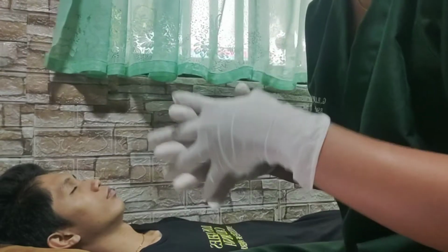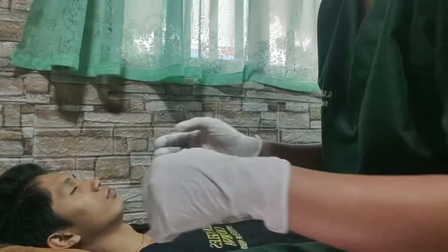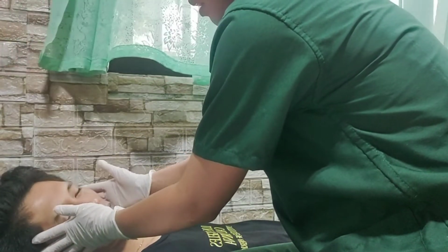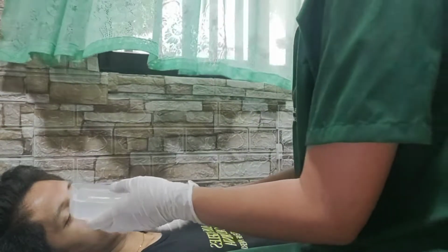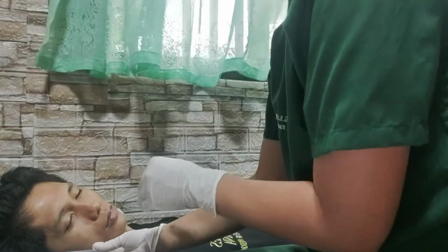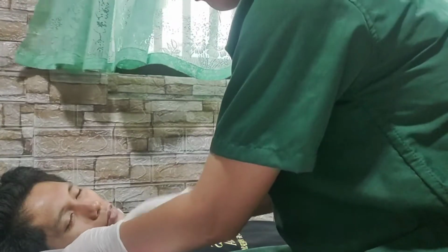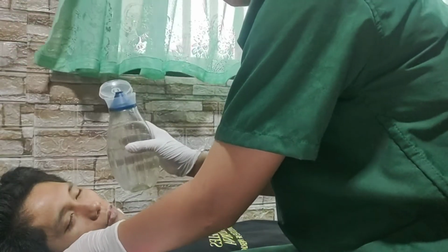So next, instruct the patient to tilt the head on the affected side area. Sir, please tilt on the affected side. Then, place the kidney basin on the affected side area to catch the outflow. Next, wash the eyelashes and eyelids with prescribed solution at room temperature. So let's assume this is the prescribed solution.